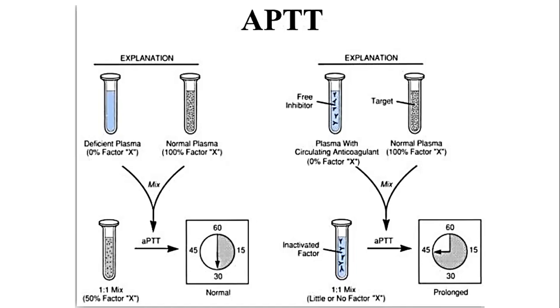How did we confirm nga may inhibitor manggid sa samples ng pasyente? We mix the sample of the patient with another plasma sample nga may unod sang isa ka specific na clotting factor. Okay? In this case, ang ginhimo ta, nag-add ta sang sample na may clotting factor 10. And nagwa, after mixing, gin-test for APTT, nagwa prolonged APTT result, which means may ARA inhibitor against clotting factor 10 ang pasyente.